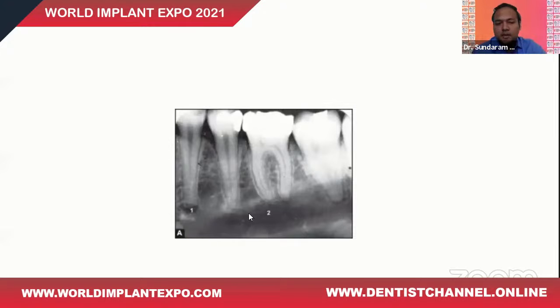This undoubtedly represents the periapical pathology of the first premolar in the lower, and this is again an improper angulation of the intraoral periapical radiograph showing the inferior canal that's been really elongated, which is not actually so, right? The number one represents the normal anatomy, that is the mental foramen. In this case, it can easily be mistaken for a periapical pathology associated with number 4.